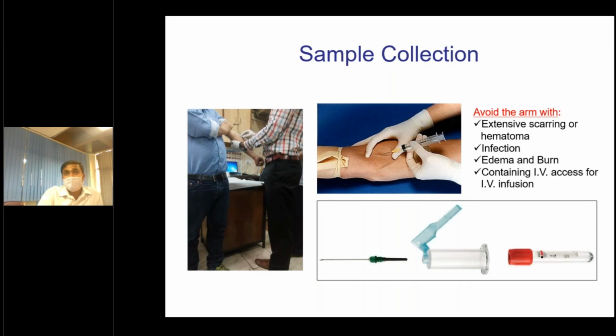It is best to use a multi-sample needle and the needle holder so that the appropriate amount of blood automatically gets filled into the vacutainer, and it is easy to change tubes without drawing out the needle, in contrast with the needle where you use a syringe.